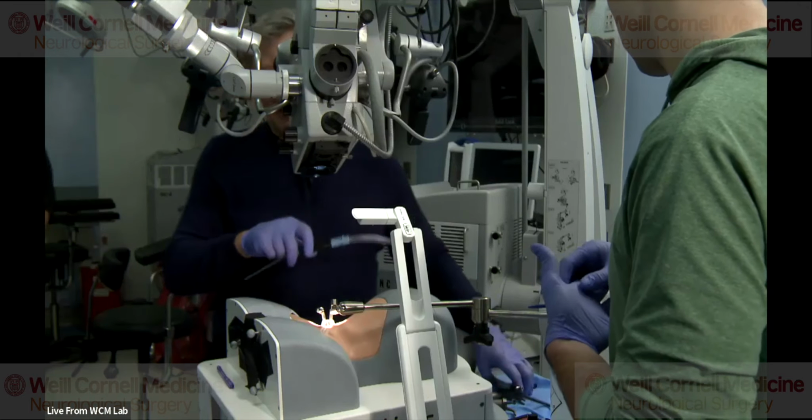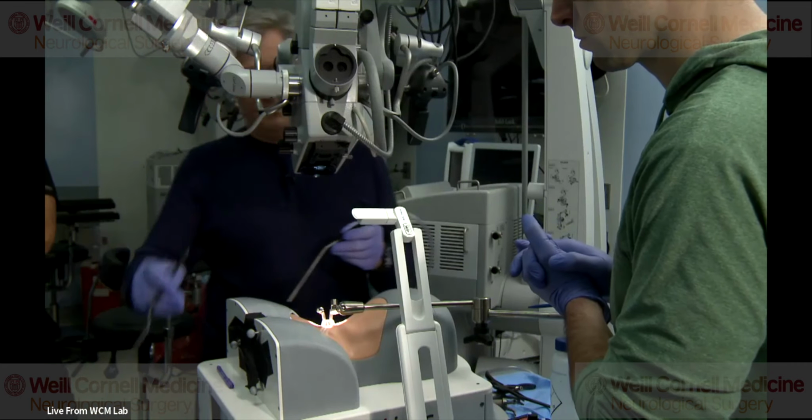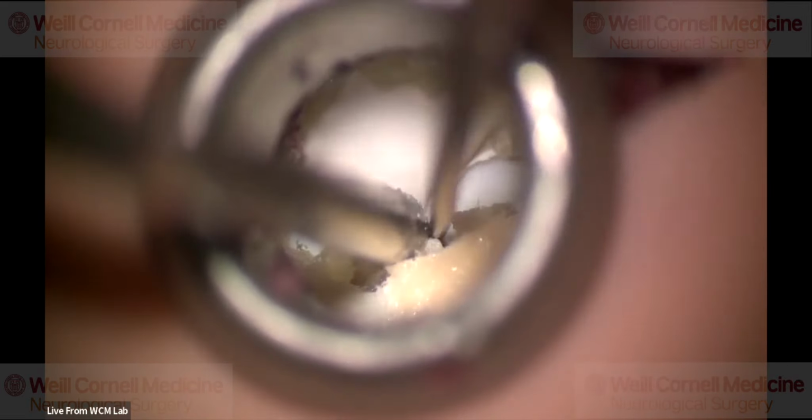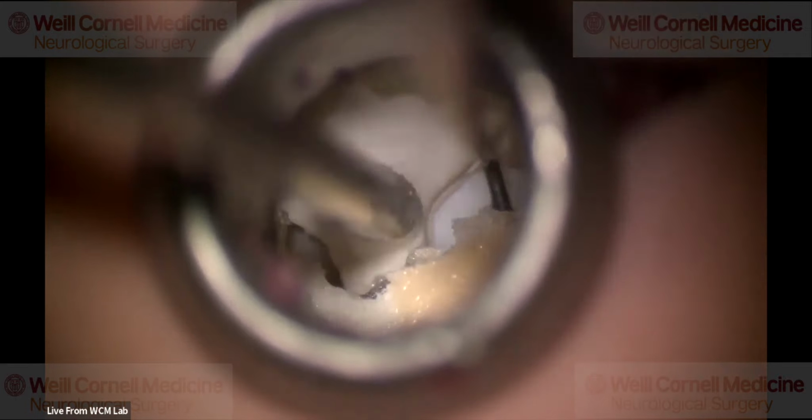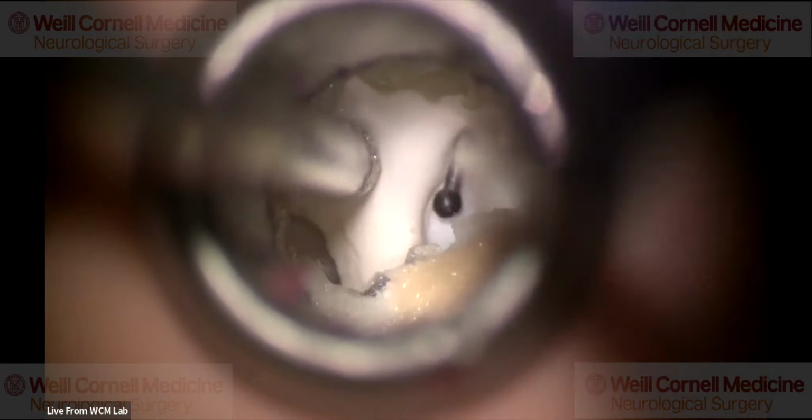So now I'm going lateral, feeling for the pedicle again. Where's the ball tip? Now with the ball tip, I'm feeling the pedicle below. See here, the smooth surface of the pedicle. So I've got the C5 pedicle, I've got the C4 pedicle. I know the nerve root is somewhere in between.